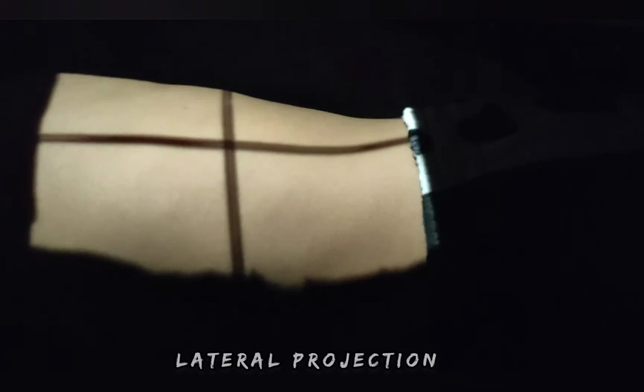Lateral projection, lumbar spine. Patient position is lateral position. Part position, align mid-coronal plane to CR and midline of the table. Ensure no rotation of thorax or pelvis. CR perpendicular to IR. For larger IR, center to level of iliac crest, L4 to L5, while for smaller IR, center to L2 to L3 at the level of lowest costal margin.